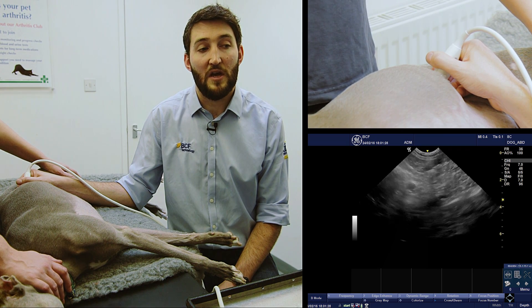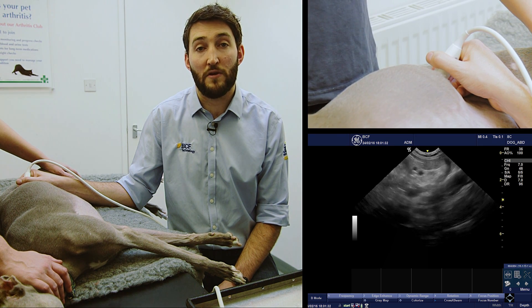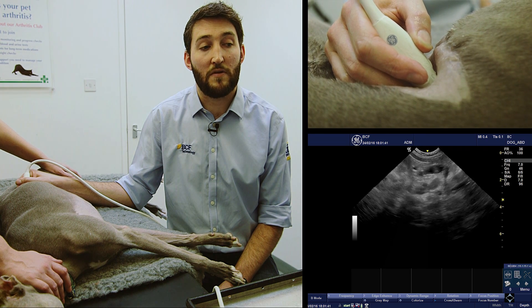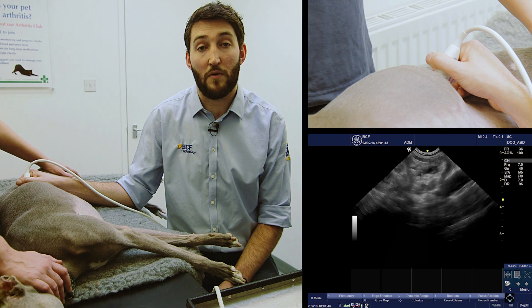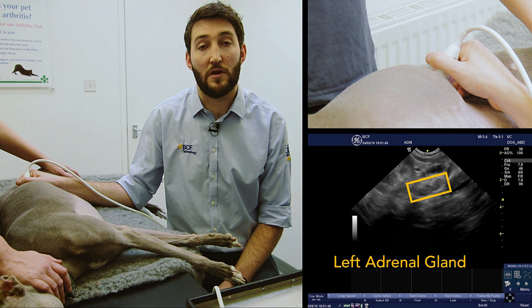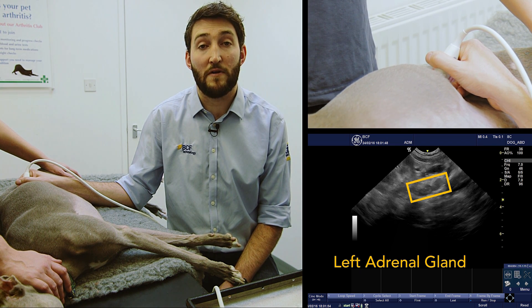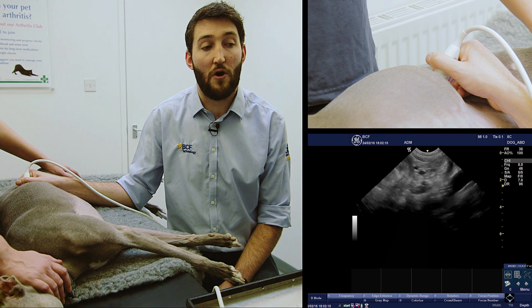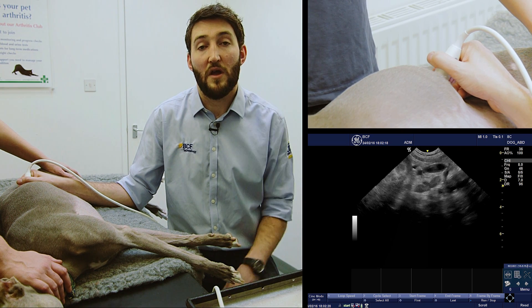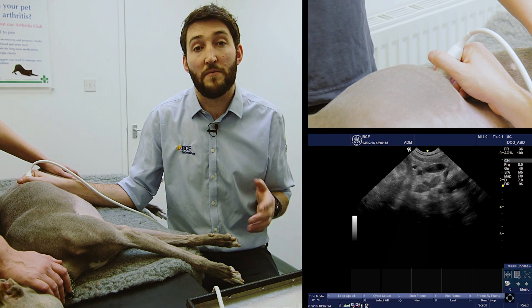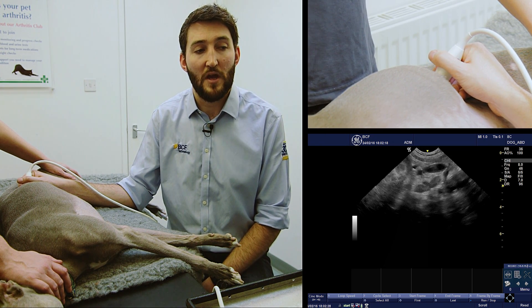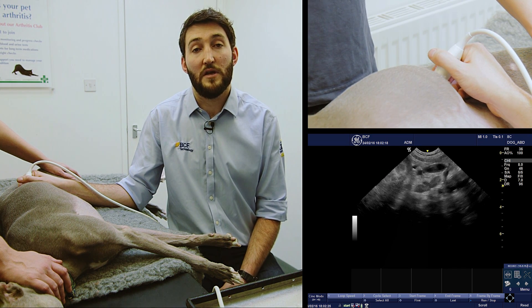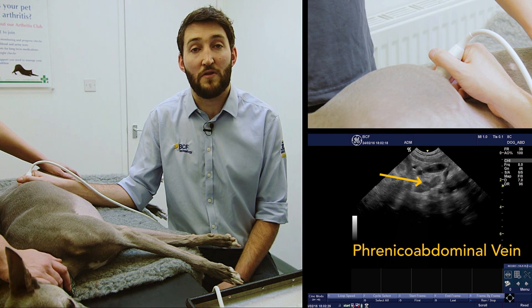That's our aorta and renal artery coming off it. Once we've located that vessel, we look in the region between the two — in the crook formed by the aorta and the renal artery. From here, tiny fanning movements up and down should bring into view a peanut-shaped hypoechoic region, approximately five millimetres or so in diameter across the narrow plane and several centimetres long depending on the dog's size. If I freeze it there, we can clearly see that peanut-shaped structure lying in that region.